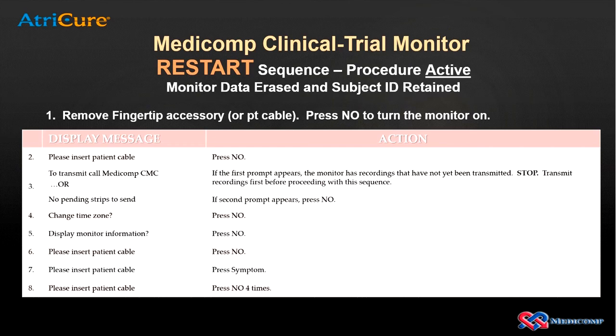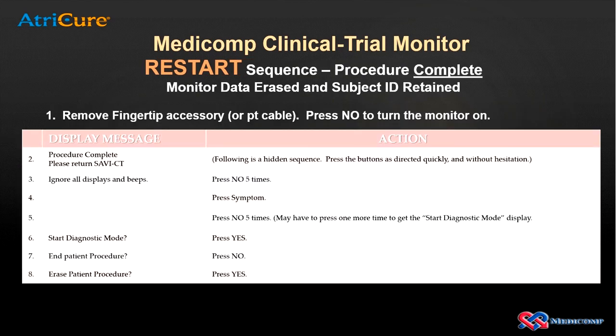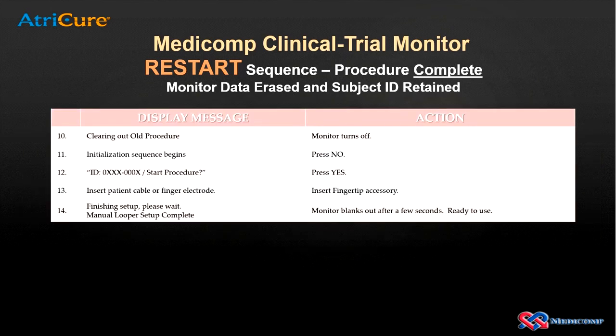So the restart slides you are seeing now outline these 2 sequences, one for restarting the monitor during the procedure, and one for restarting the monitor after the procedure has completed. We will not go through the step-by-steps in this video, but we wanted you to be aware of them. You should have received the PDF copies of these instructions with the video, which will better guide you on how to restart the monitor if and when needed.